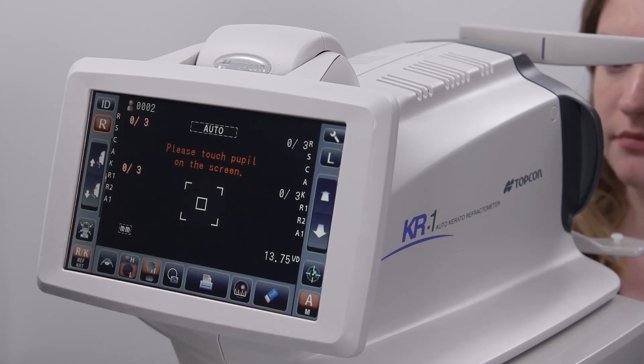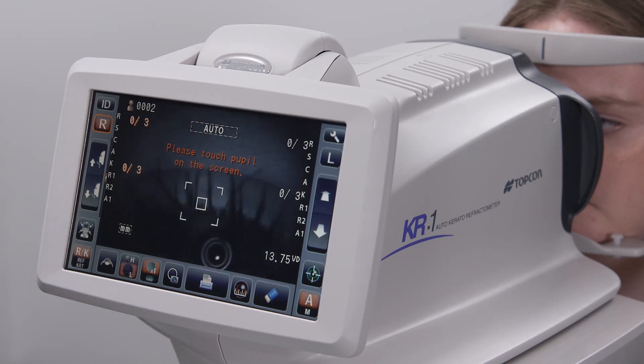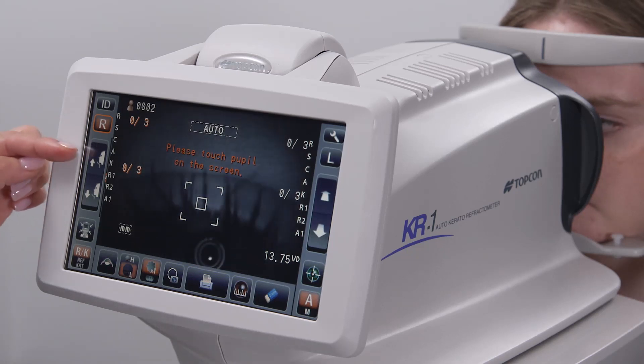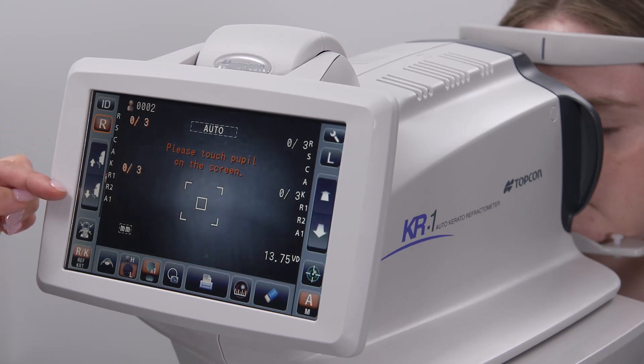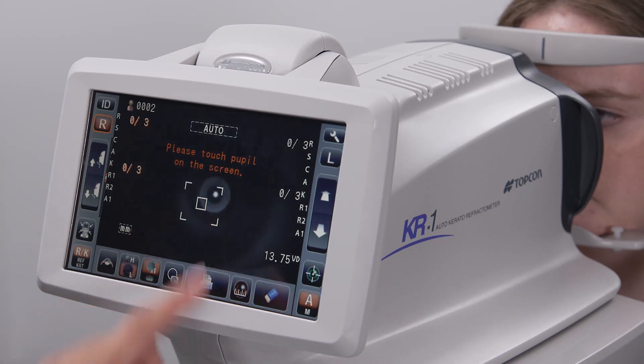Next, have the patient place their chin down and forward in the chin rest, and their forehead forward against the forehead rest. Adjust the height of the chin rest using the up and down icons at the left of the screen, until the patient's eye is aligned with the canthus markers on the posts at either side of the patient's face.